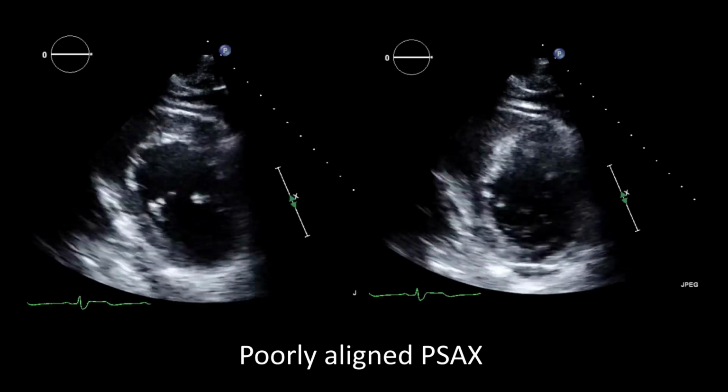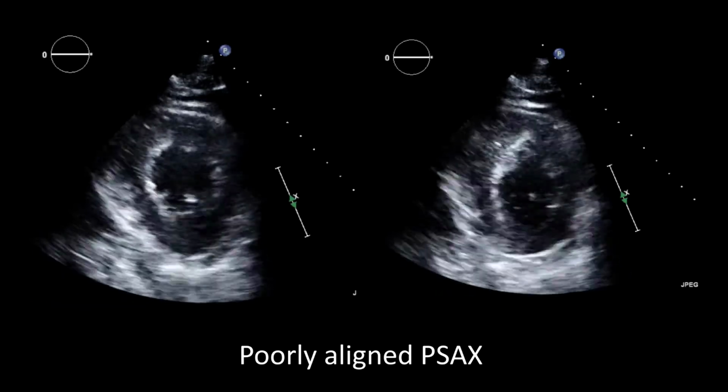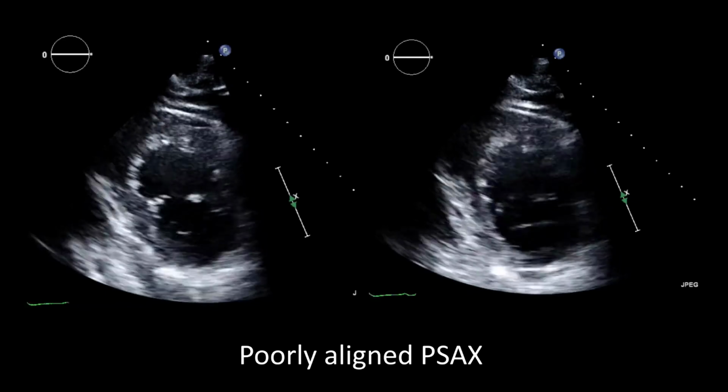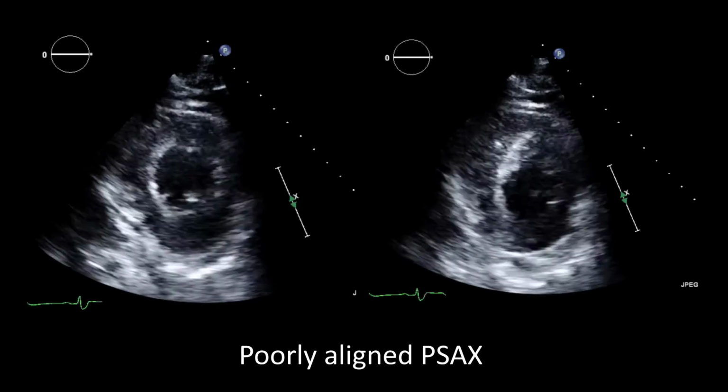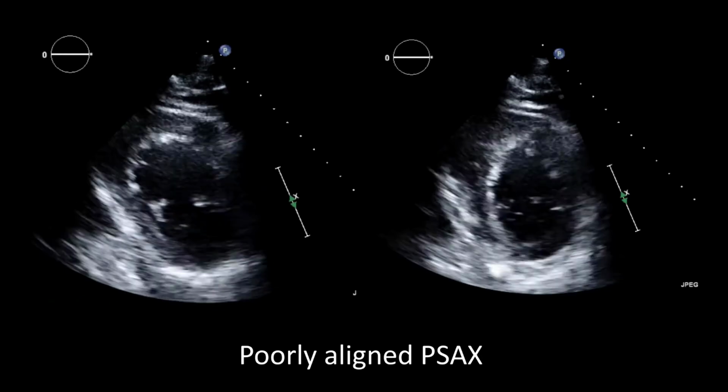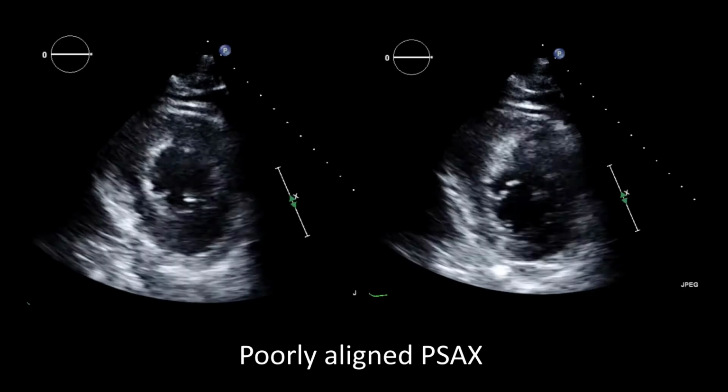Proper correction is usually done by a combination of two movements. First, sliding towards the apex, and second, slightly fanning. This will displace the probe over the mid portion of the LV and cut the LV perpendicular to its long axis. Most adjustments in this view are done with this combination.